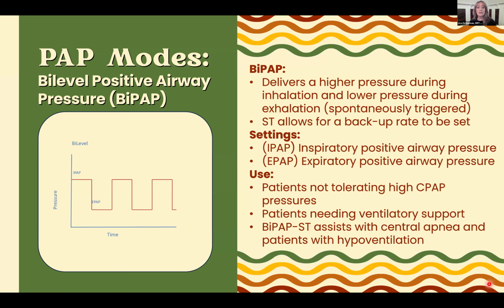And then we have BiPAP ST. So patients with central apnea or periods of central apnea, we can add the backup rate so that if they do fall off occasionally, they do have some central apnea, it will push those bilevel breaths. Now, you often are not getting the same full breaths that they're taking on their own, but it does provide some backup support there.